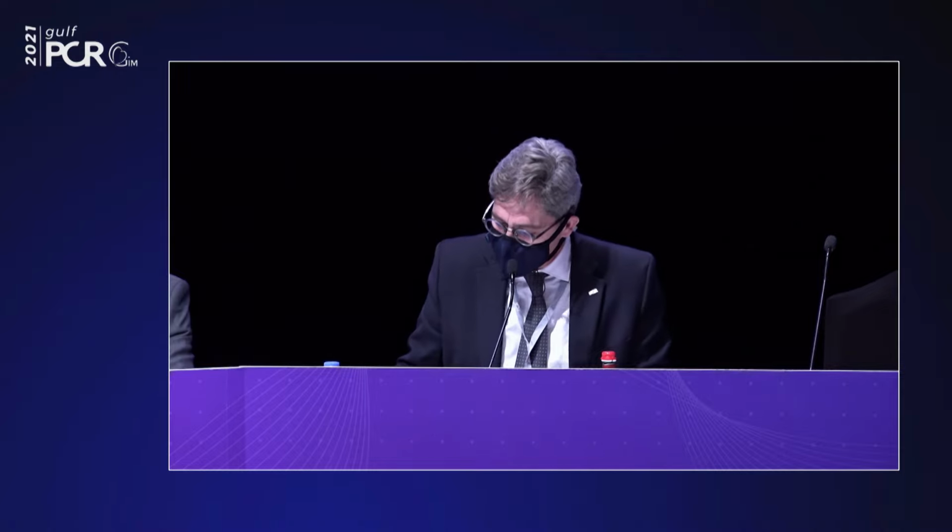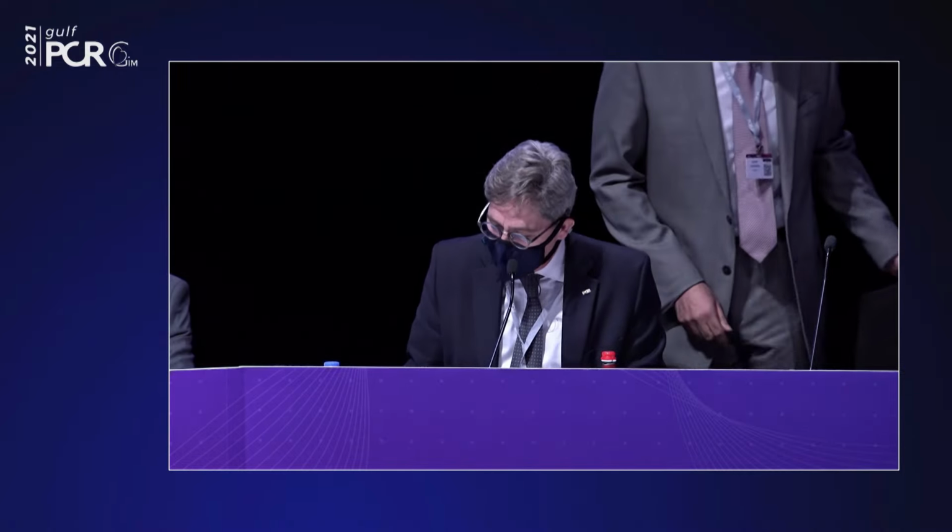Now we move on to Darius Dudek. And he will give us some case examples of how to do imaging and physiology in ultra-low contrast PCI cases.